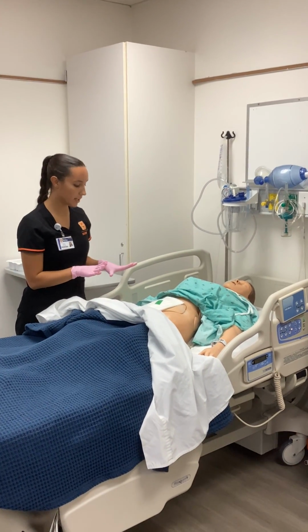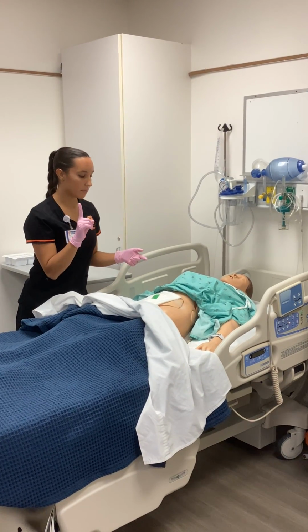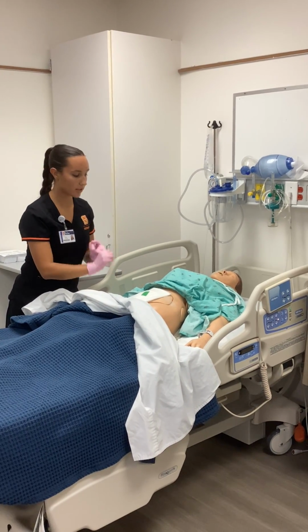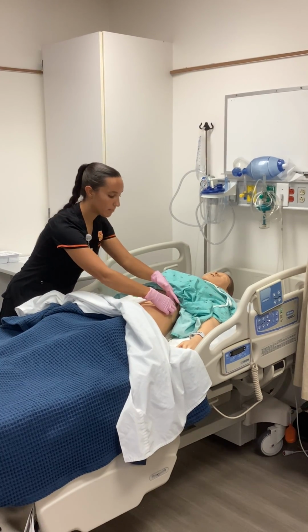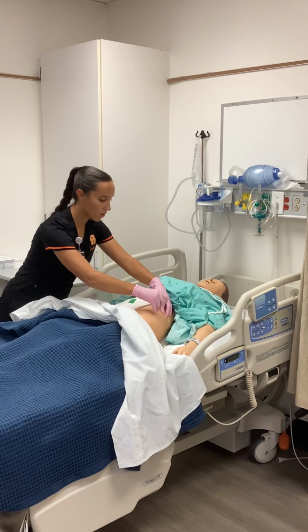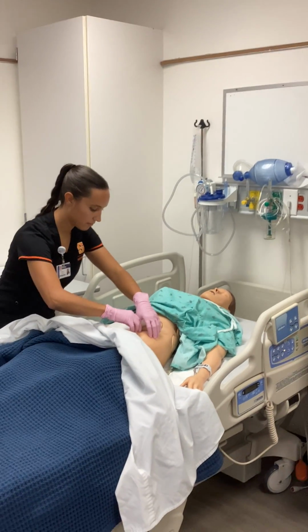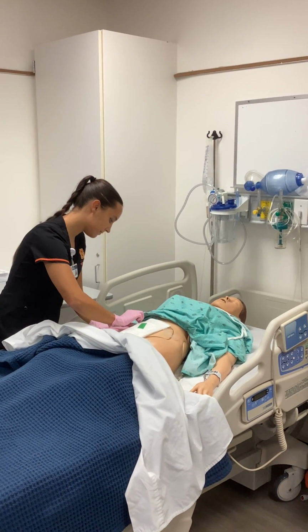This is very important because we don't want to tear the skin that's around it. So if it was difficult to take the bandage off, we could use an alcohol wipe or saline. But as of right now, I'm going to try and just pull up the corner and hold the skin and just pull off the corners first, and then I'll take the bandage off.